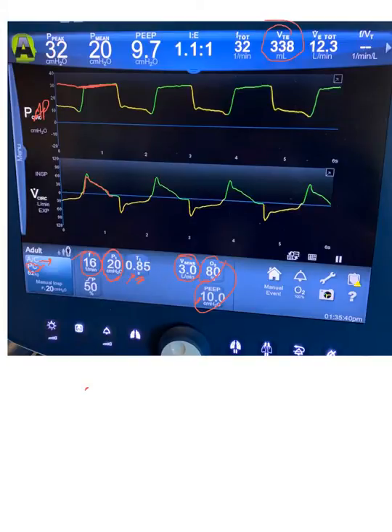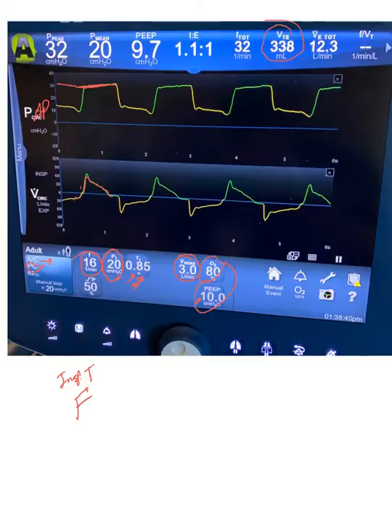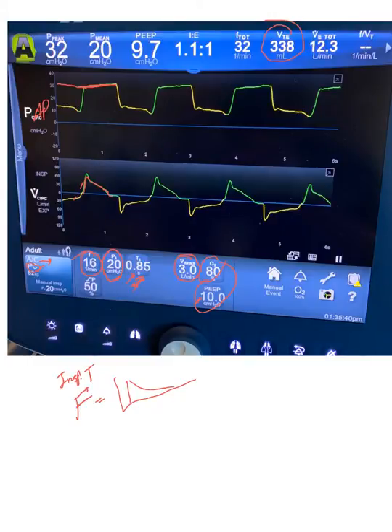The flow is not directly set because it can be variable. By default it follows a decelerating ramp pattern, for the reasons we explained in previous videos.